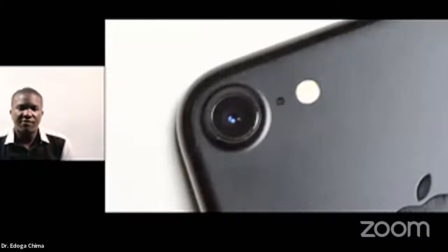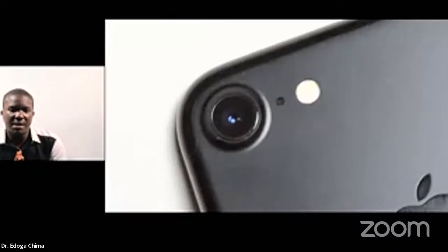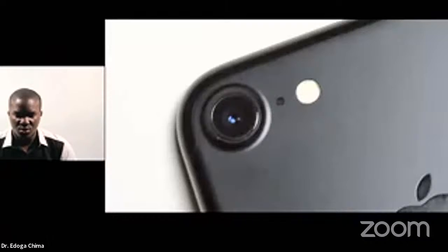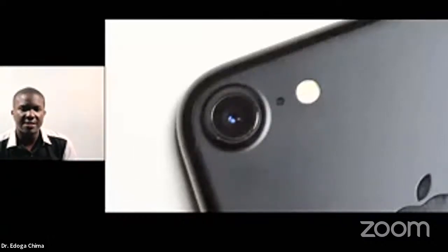So the flash is in a position to be coaxial with the camera, so that the camera light is going to be passing through the condensing lens to illuminate the retina, and then the image that is formed is actually formed in between the lens and the camera. It is an aerial image that is horizontally and vertically inverted.